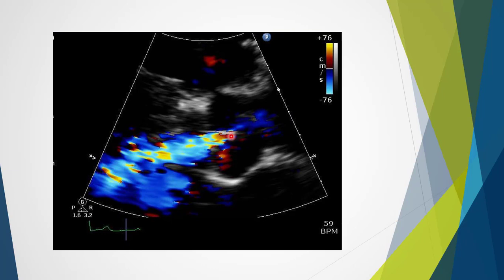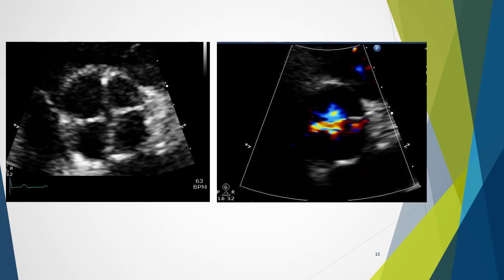The site of coaptation is relatively centred, so we wouldn't normally assume a bicuspid valve. However, when turning to short axis, it becomes evident there is actually a quadricuspid aortic valve with a typical cross-like appearance. As expected, the aortic regurgitation is fairly central in its origin.